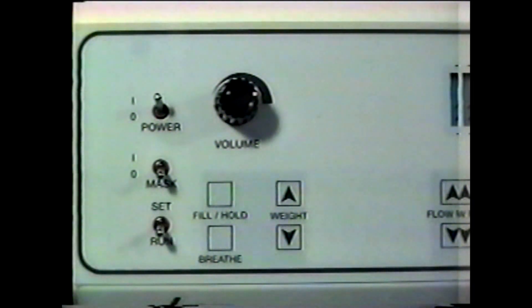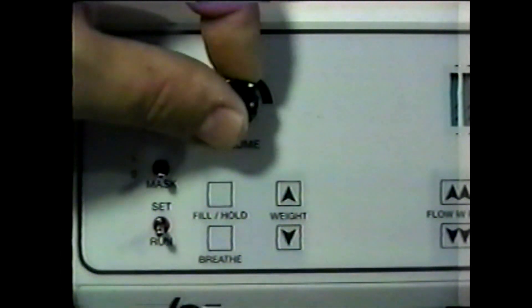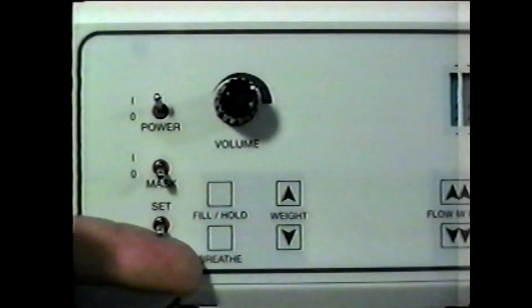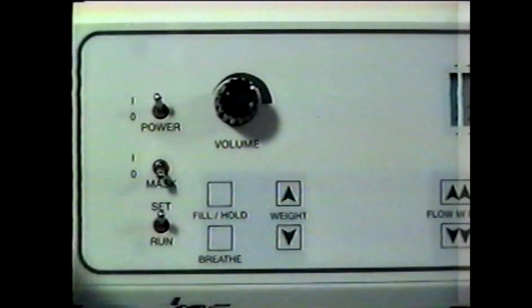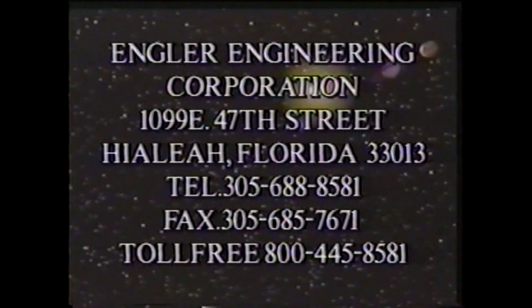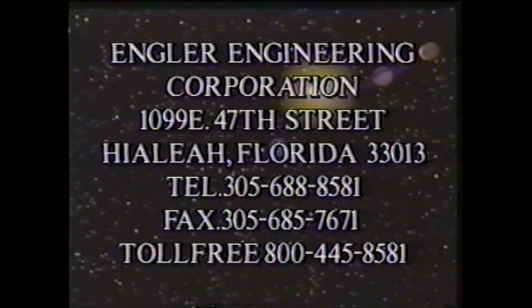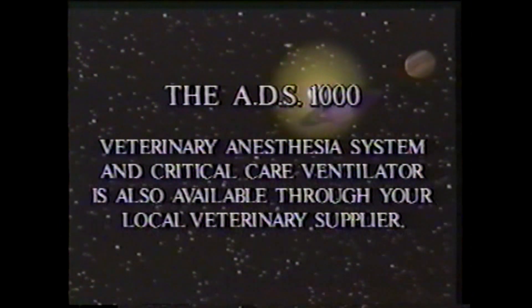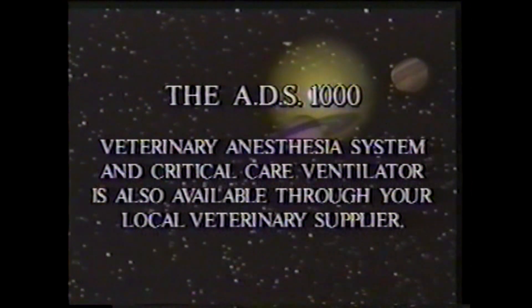The volume knob controls the alarm volume of the ADS. If you hear the alarm, switch the ADS from run to set and check all of your connections. For further information on the ADS-1000, please contact Angler Engineering Corporation at area code 305-688-8581 or 1-800-445-8581. The ADS is also available through your local veterinary supplier.